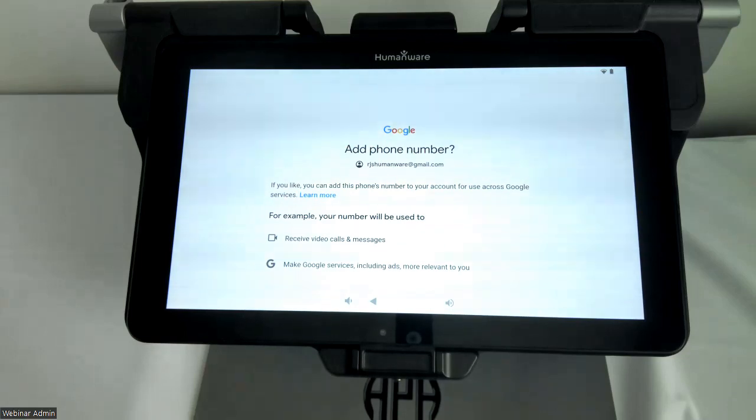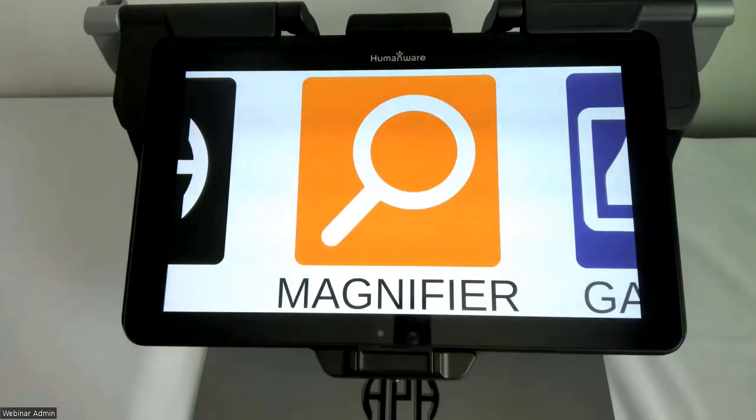And if you're curious to see how an activation goes in complete detail, go ahead and visit our website and view the other videos that go through the complete activation process. Okay, as you can see here, completed successfully the activation of this Mat Connect tablet, and I have Prodigy set as my home application here.